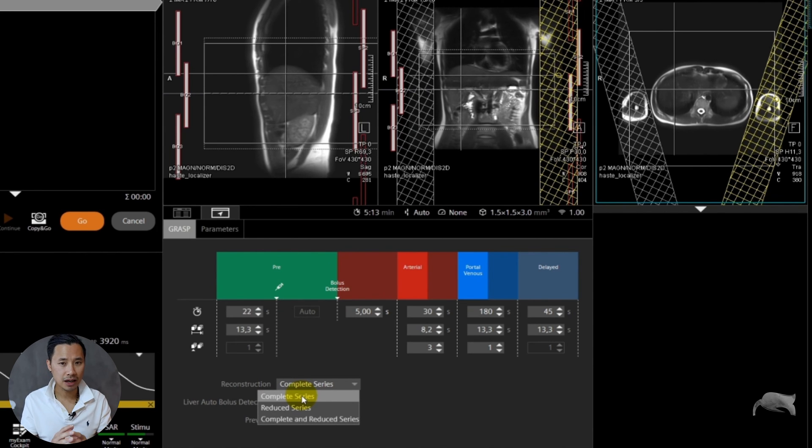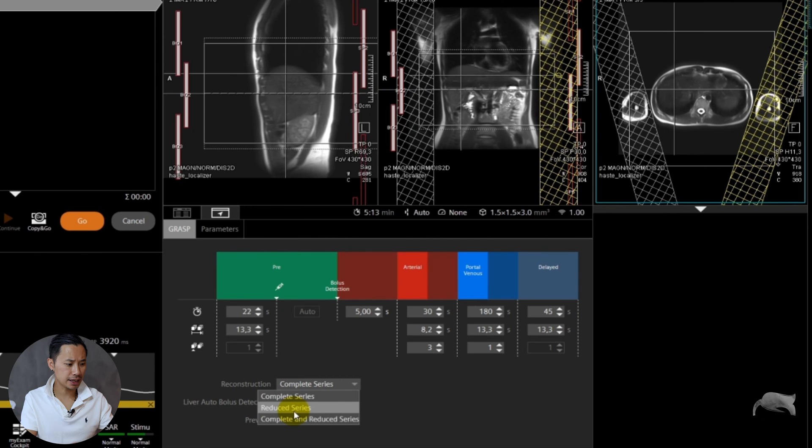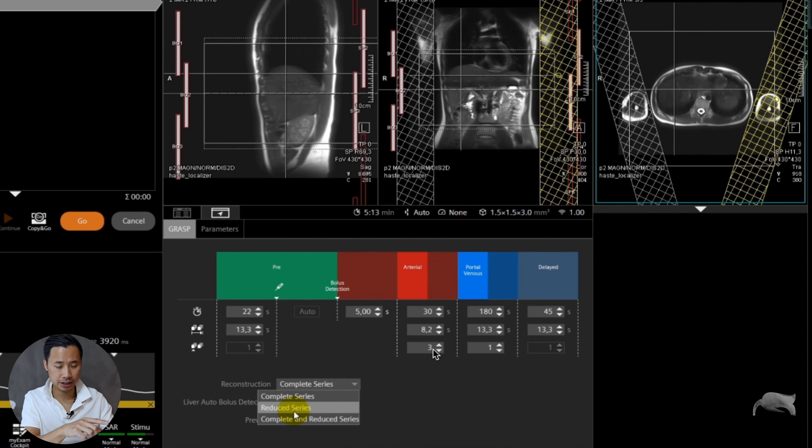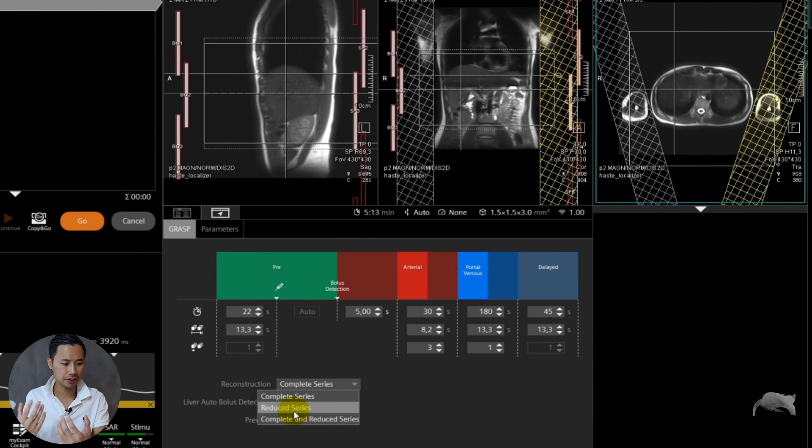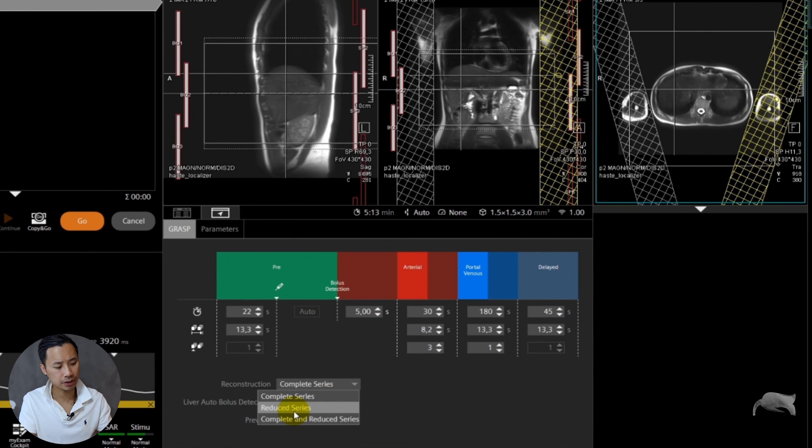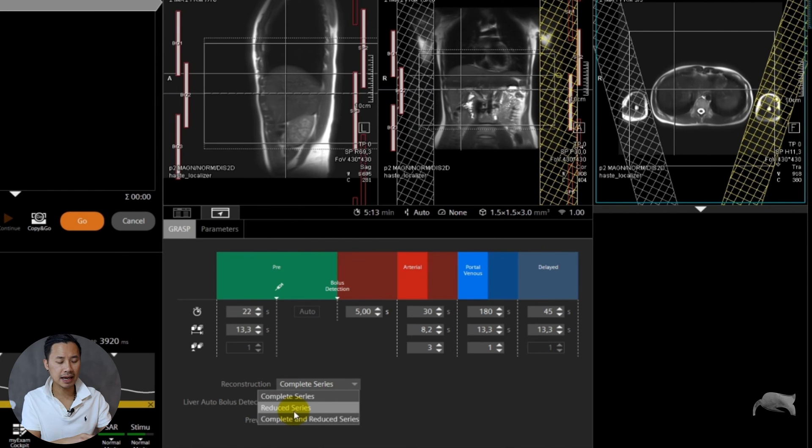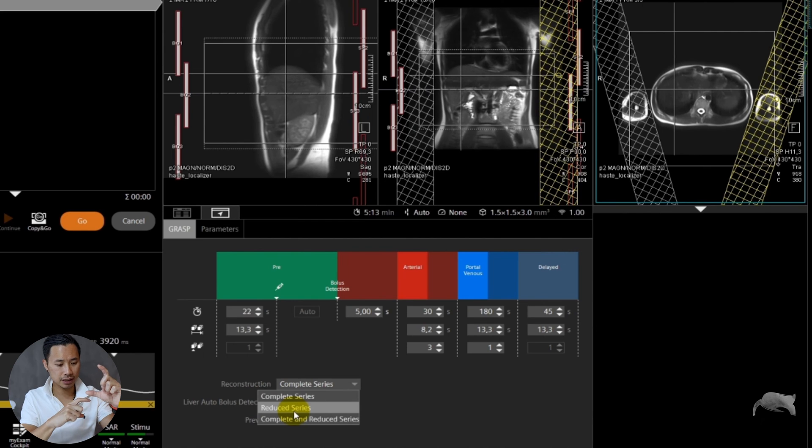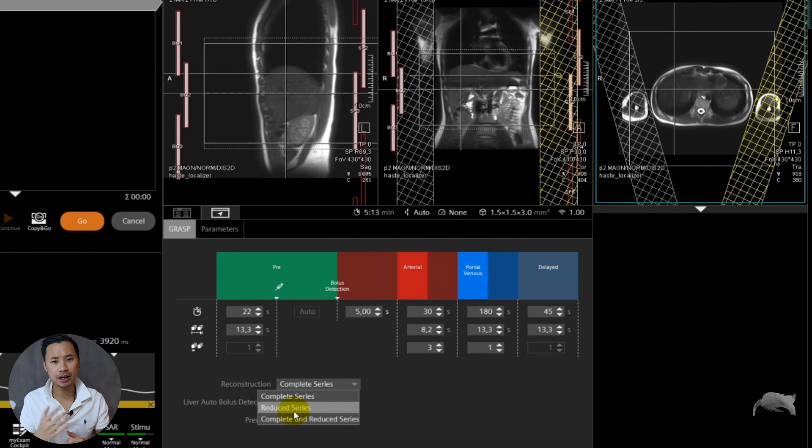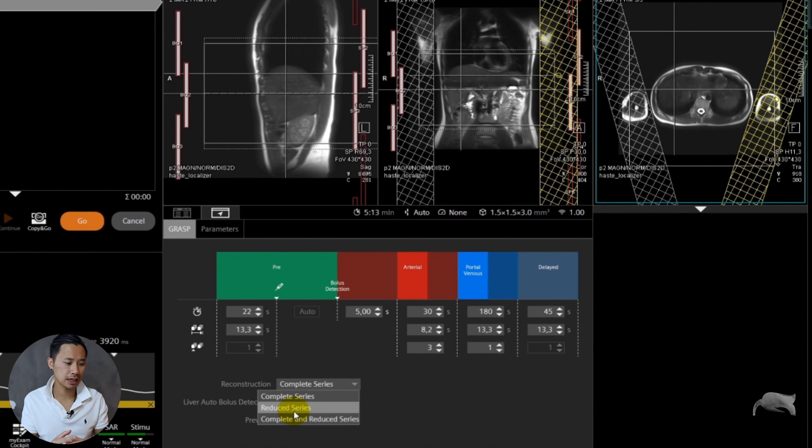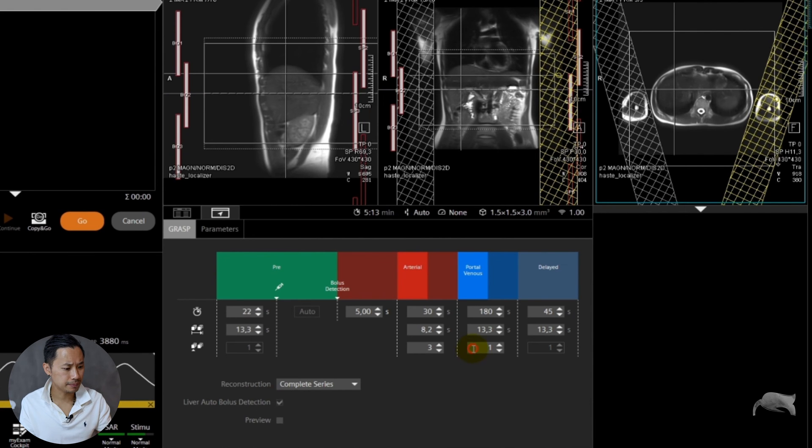However, you have the possibility to use reduced series. What does reduced series mean? It means you get one pre-image, three arterial as you wanted, one PV and one delay. This is more what radiologists are used to seeing whenever they're doing the old school way. You have the last opportunity to choose both complete and reduced. It will become two large stacks or sequences. In the beginning it will be okay to have that. The radiologist will be used to seeing what they have available, and then you can talk to the radiologist and find out what kind of series you want.